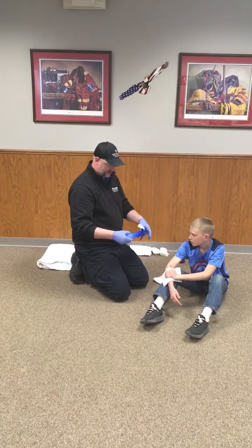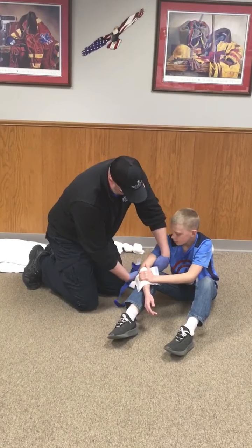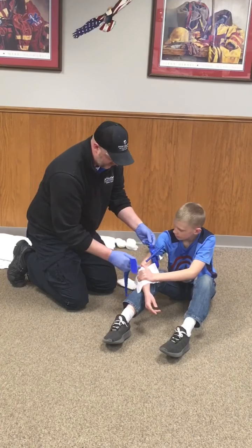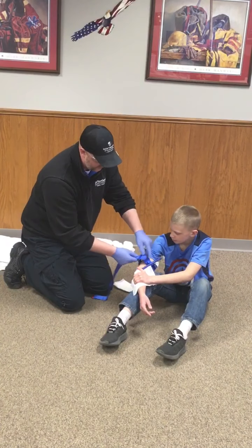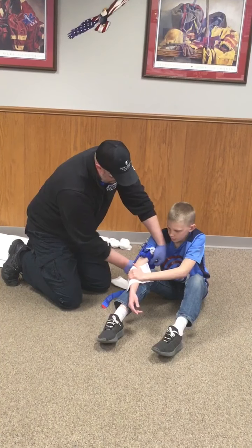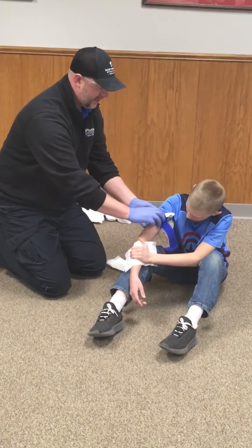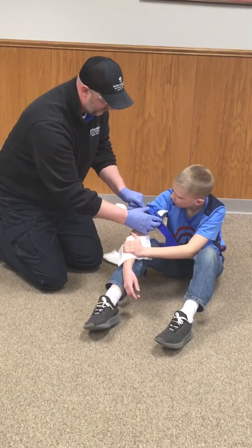I'm going to grab my tourniquet. Just like all tourniquet management — if we can get it below the joint and above the wound, we can. If we're going to be over the joint, we may have to go above the wound. We're going to apply the tourniquet, pulling it tight, making sure it's snug with the Velcro, and then start twisting the windlass until the bleeding stops.